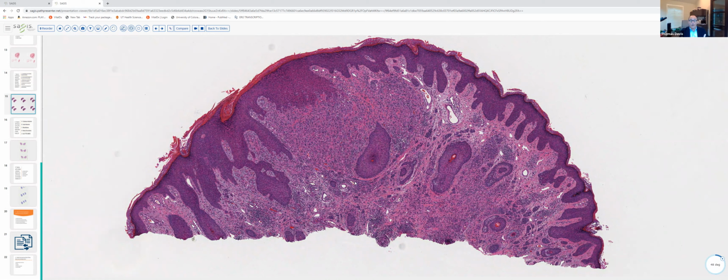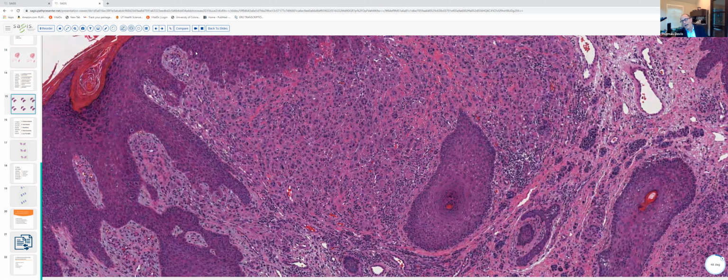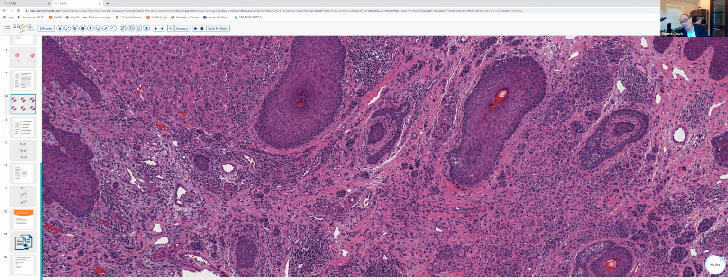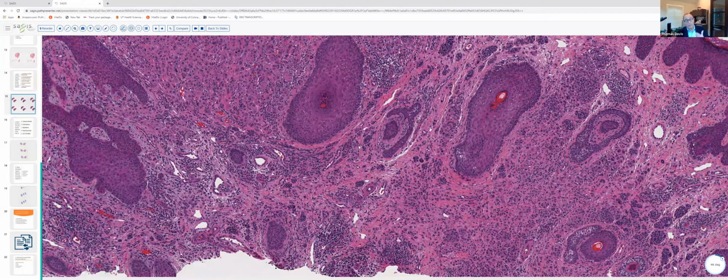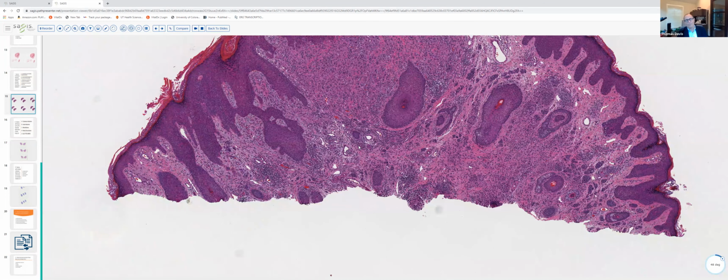And we would confirm that, of course, with a BAP1 immunohistochemical stain, which would show absence of staining in these more atypical melanocytes and strong nuclear staining in the banal appearing melanocytes, and indeed in every other cell here, in the follicular keratinocytes and the epidermal keratinocytes. They would all express or be stained with the BAP1 immunostain.